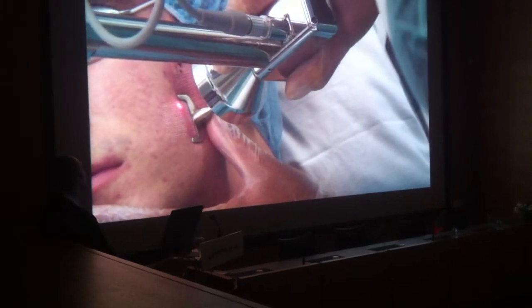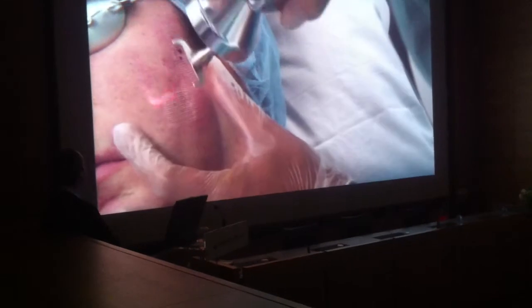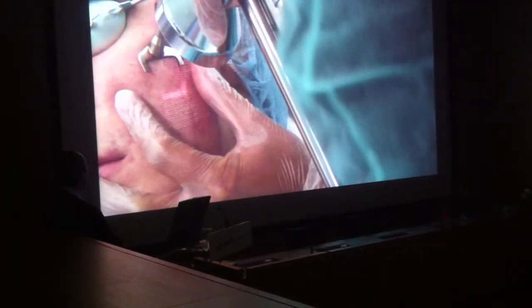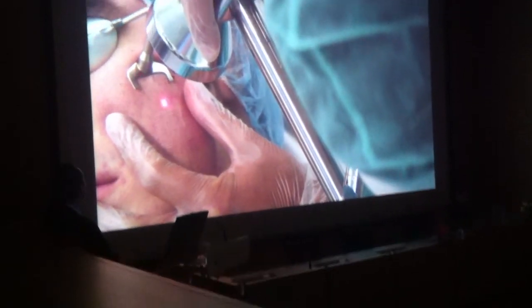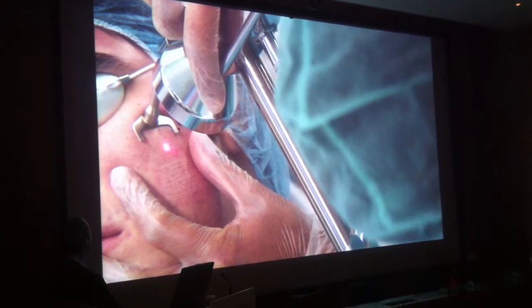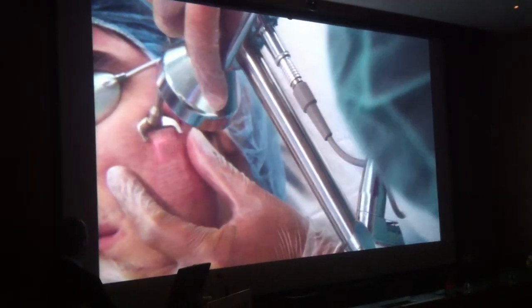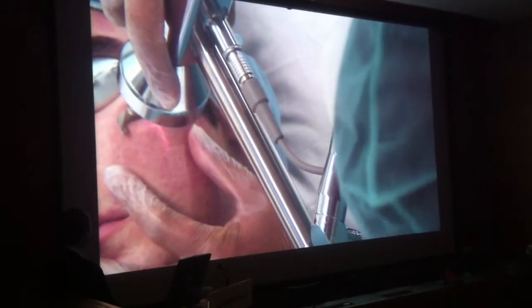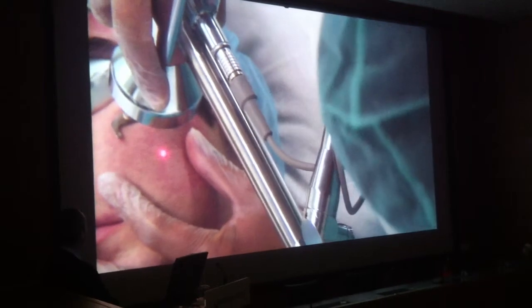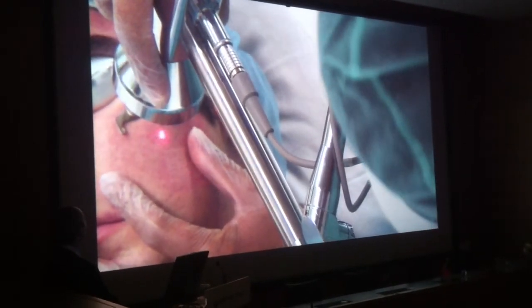The power of the machine lets you treat large areas quite fast. If I can have a gauze, please. A gauze. So basically, you can obviously tune. This is a relatively deeper treatment in the scarred areas, but then I'm going to feather the rest of the face with a micropeel so that we don't have tide marks.